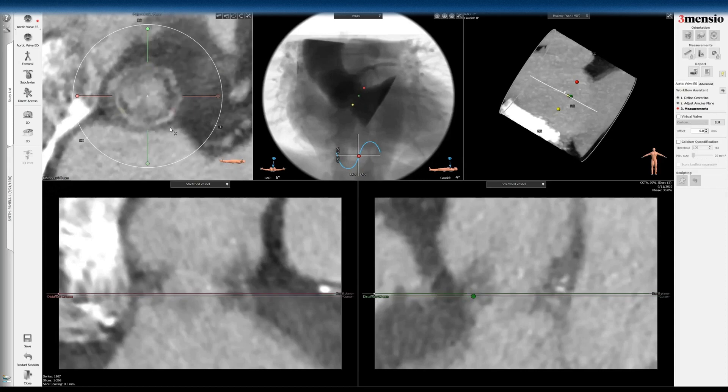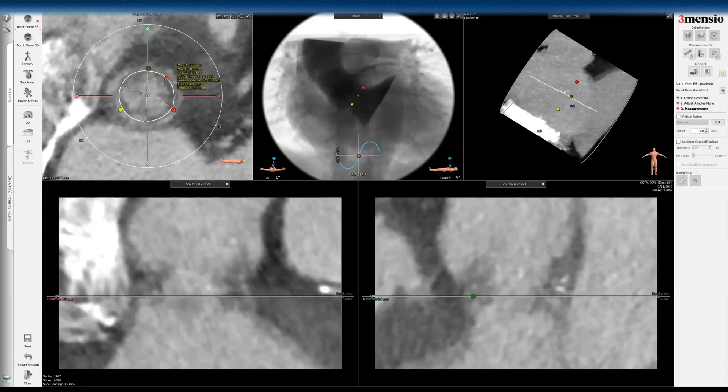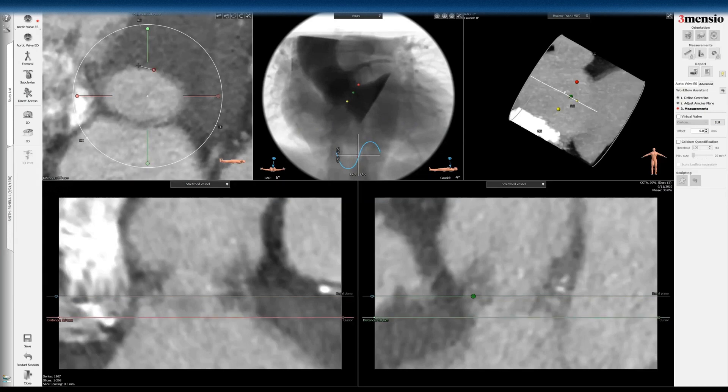I'm going to go inside that white frame. So this is the annulus. And then I go to the LVOT view and measure the LVOT. It's less relevant here because it's a surgical stent valve — unlike a homograft or a freestyle aortic root stentless valve — so it's less of an issue.